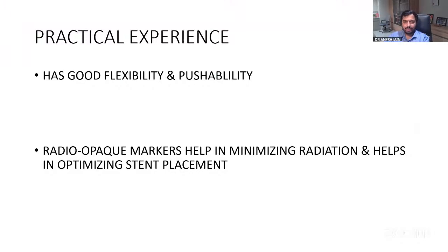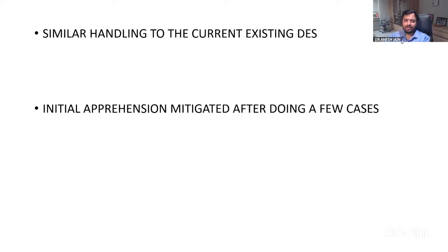So in my practical experience, I found that this stent has very good flexibility and pushability. The radio opaque markers help in minimizing the radiation and help in optimizing the stent placement without using excessive cines and stent boosts. It has very similar handling to the current drug-eluting stents which we have on our shelves. And the initial apprehension was mitigated after doing a few cases. The stent was in fact superior in pushability and deliverability, and we look forward to using it in the future as well. Thank you.